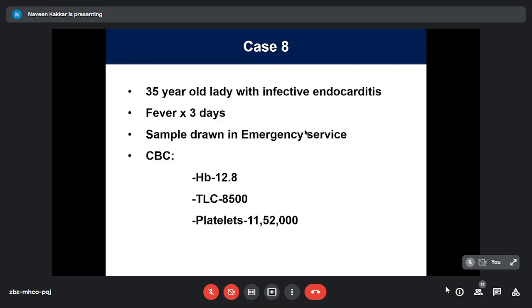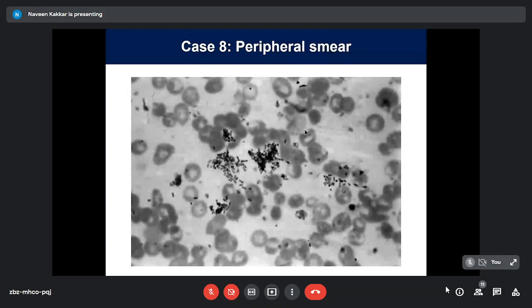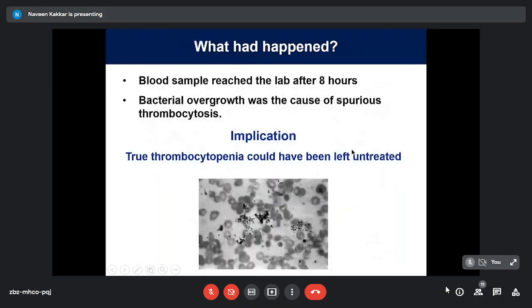Her CBC showed, again, marked thrombocytosis, more than 10 lakhs. I don't have a color picture right now, but that is what a smear showed. If you look, that's a platelet here. But if you look, these are rod-shaped structures. So these were actually bacilli.